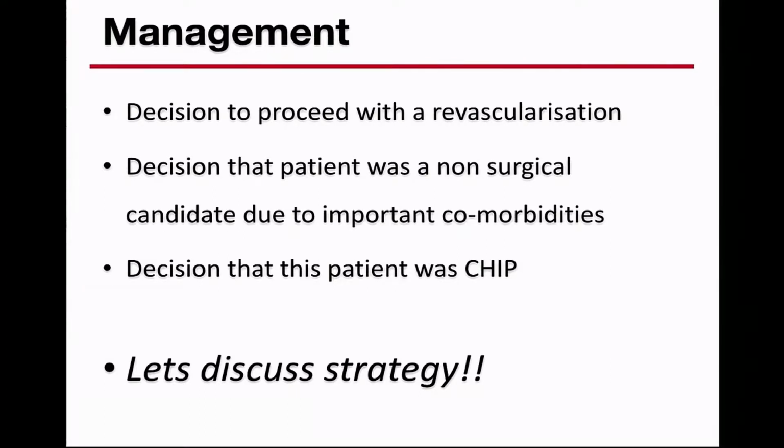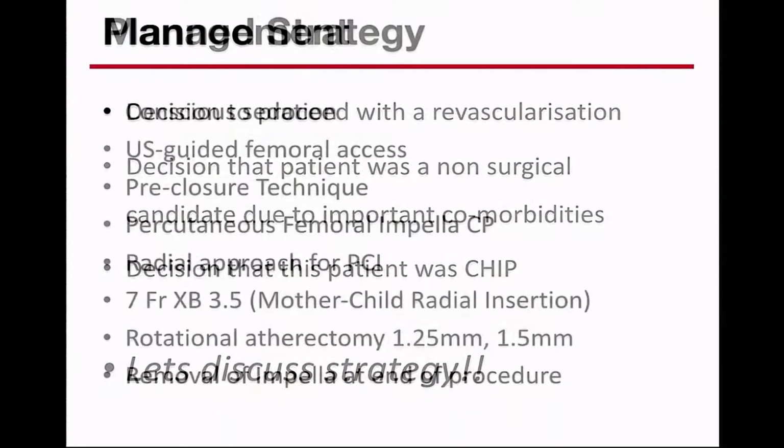So we decided to proceed to a percutaneous revascularization. Due to all the comorbidities we discussed, he was deemed a non-surgical candidate, and it was planned as a CHIP procedure. So let's talk about the strategy. For the sake of time, I'll just proceed.